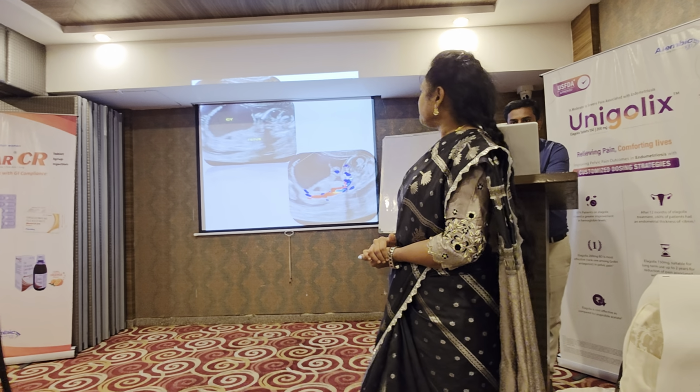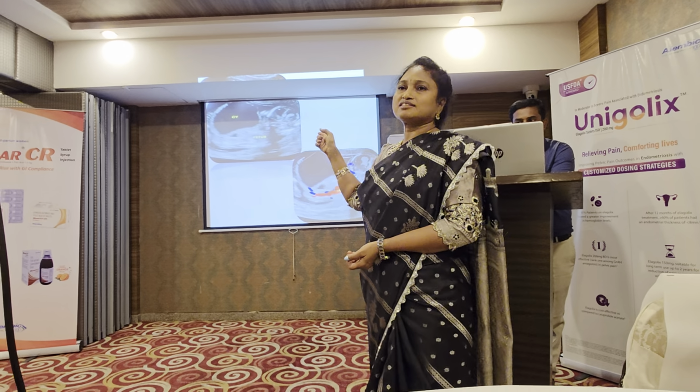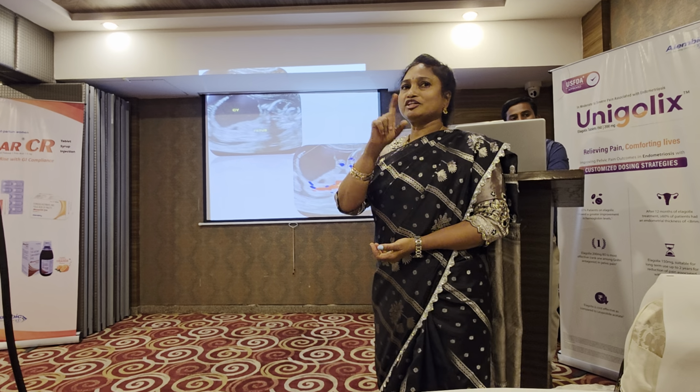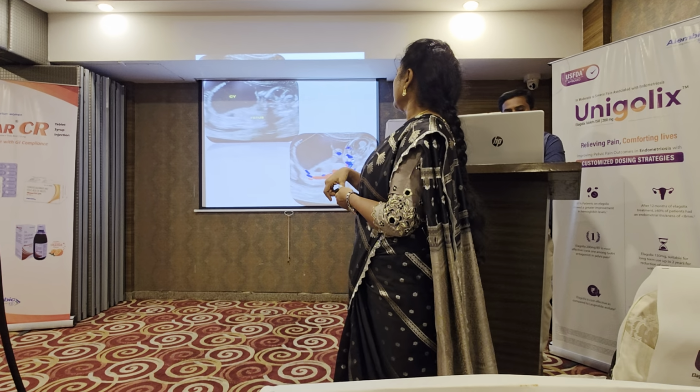So there is a cyst here. How do you know that it's an ovarian cyst or a mesenteric cyst or a bladder cyst, bladder dilatation? How do you know? How do you say, like just now I told you? Switch on color. Next one.